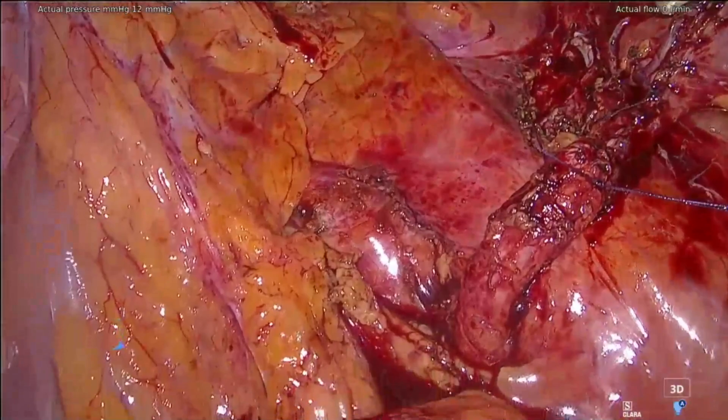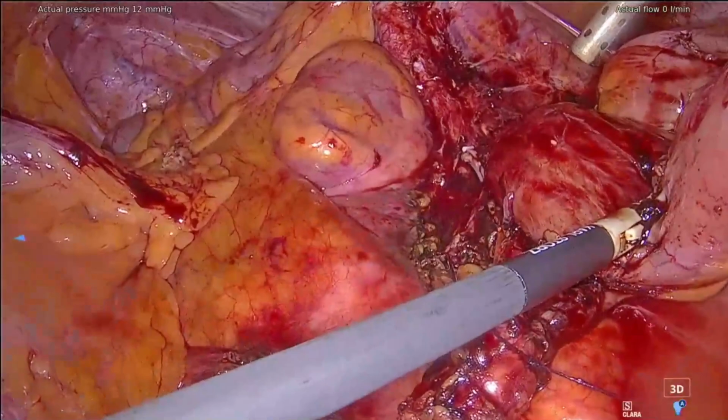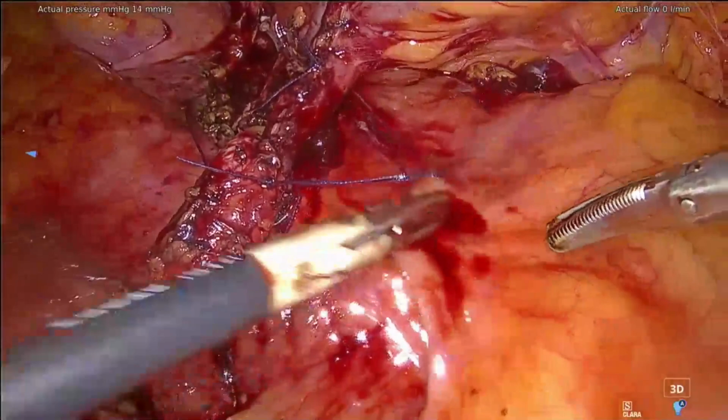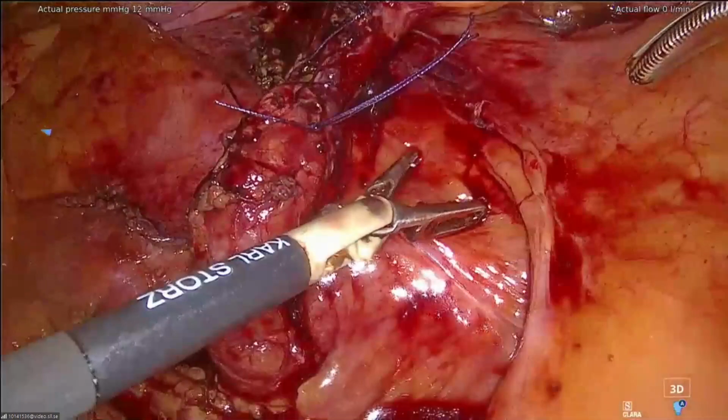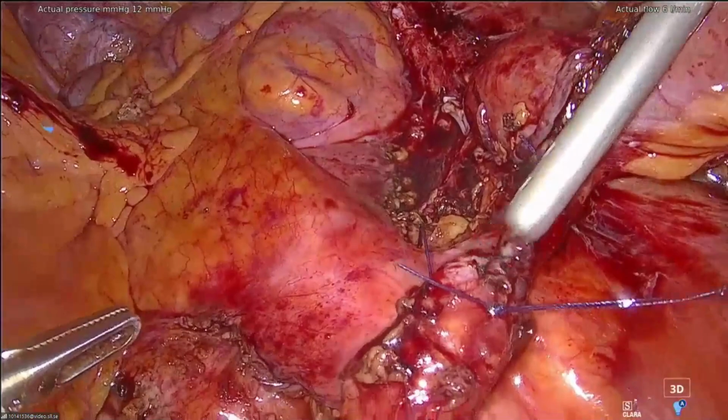Then I just have to check now what I can do to minimize the risk of that. Show me here the peritoneum. Renaud? Yes. Best compliments as usual. Very, very nice. Do you want to cover the new anastomosis, or is it okay? Oh, for me, it's good. We just want to fill with water. Do you fill with water?